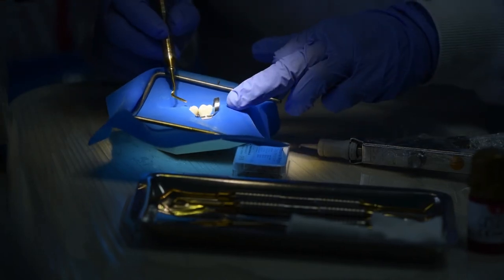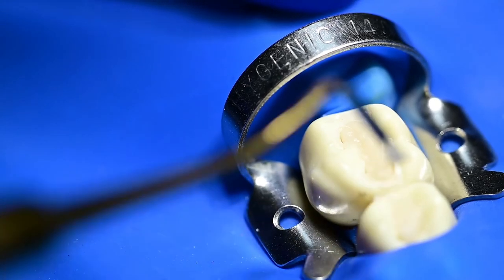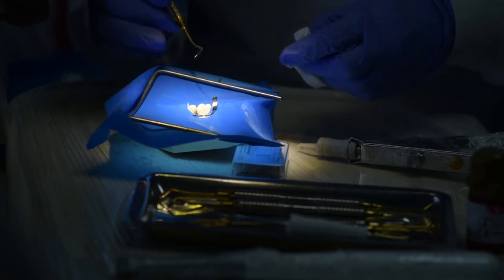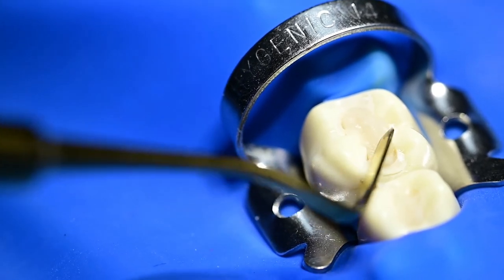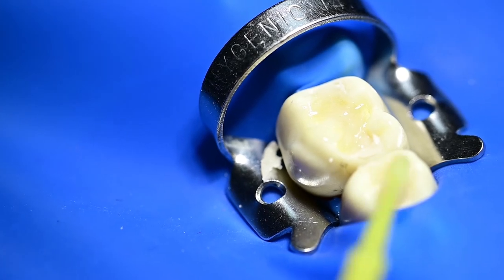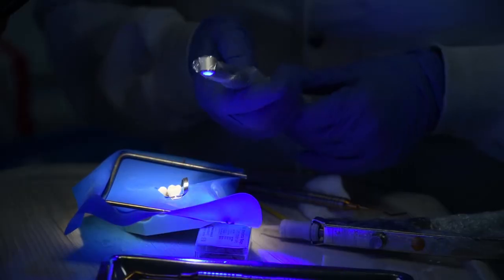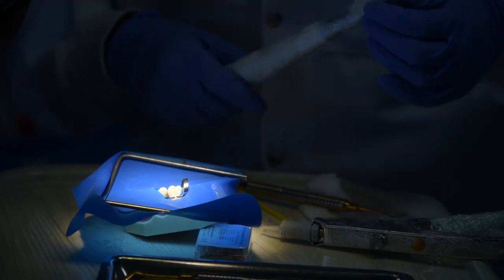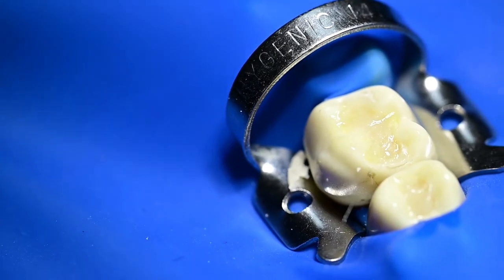During this time, there should be no moisture accessing the material. In case you are not able to control moisture, you should have applied the resin coat at this stage. So in two and a half minutes, this material sets. So I'm ready to actually apply it on the fillings. And I need to light cure. The light cure is 20 seconds. And you are very familiar with that. Good to go. Just make sure you apply it in moderate size cavities and small cavities as we wait for more clinical trials for this material.